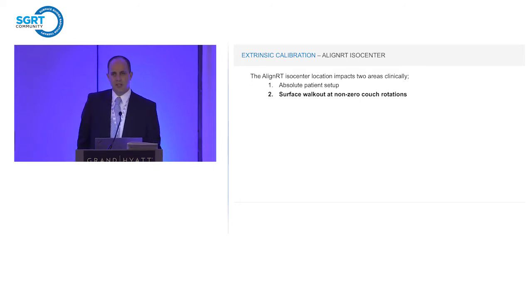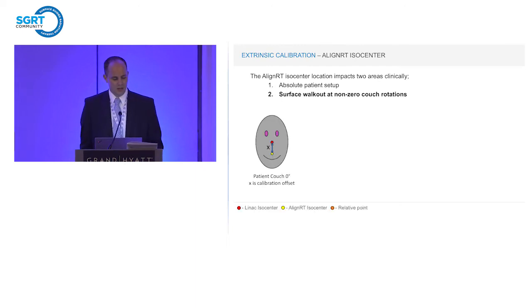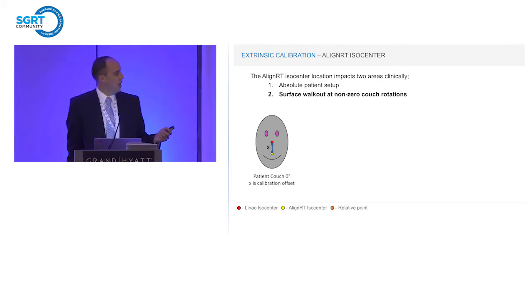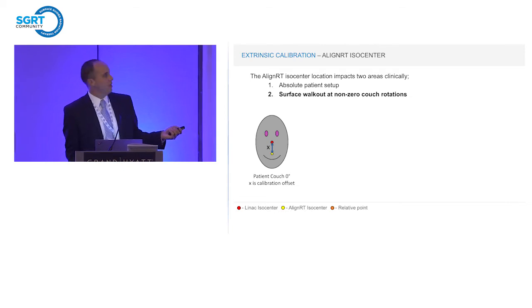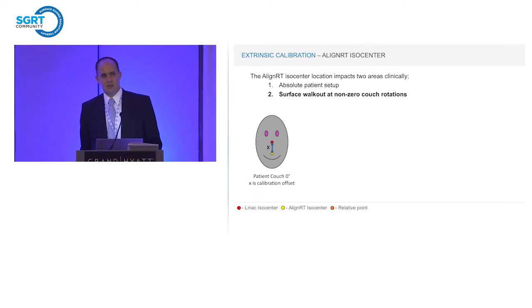I think more importantly, though, is what happens when we rotate the patient's surface, when we rotate the patient during treatment. And I just want to illustrate the impact of an offsetting calibration. So this diagram here shows a patient they've been set up to IGRT. We've had a reference surface captured. I'm depicting here in red our treatment isocenter, and in yellow we have where we've calibrated the Align RT isocenter to. So we're just illustrating here an offset between the two, so if it hasn't been calibrated perfectly.